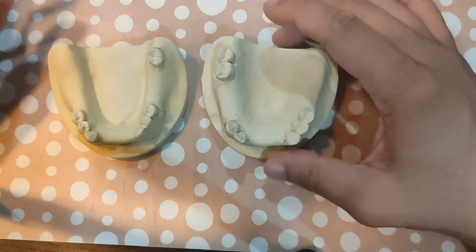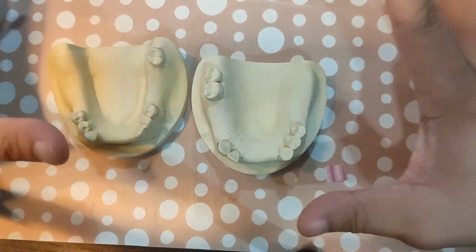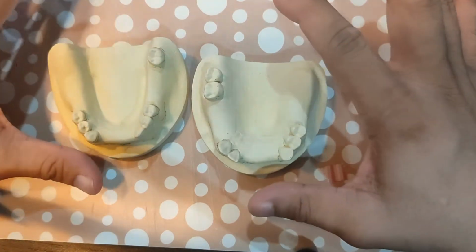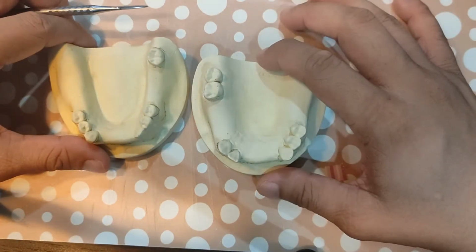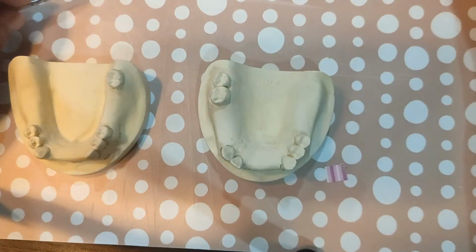Alright. So for the simulation of the mouth prep, the things that we will need to do is basically yung rest seat preps nyo. Okay, for this case, I would like all rests to be seated on a rest seat. So kailangan natin i-prep yung rest seats. So where are the rests? You just have to go back to your design.